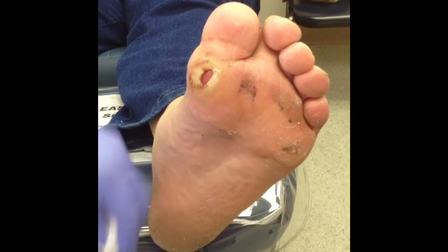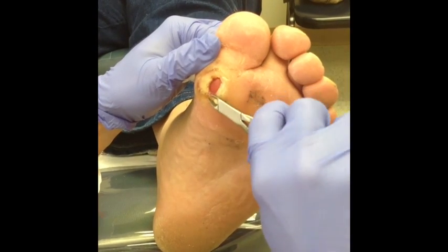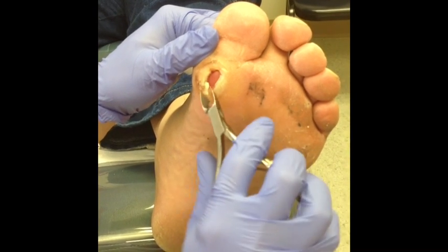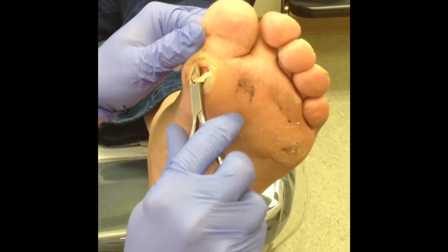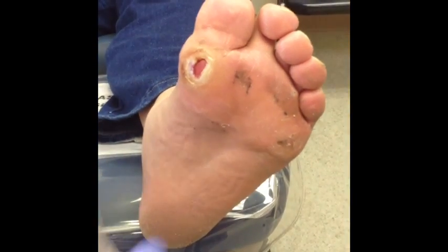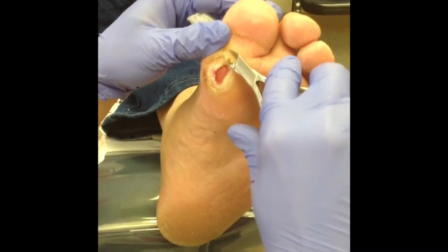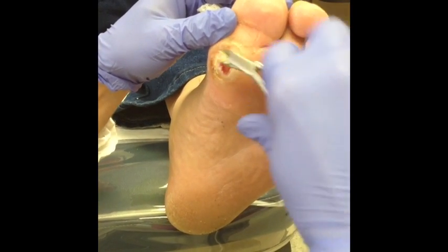Now this doesn't hurt the patient because this patient has neuropathy, but even if they didn't have neuropathy this is just removing callus. It's not actual tissue — as he's groaning up front, it's not hurting, but I guess it is. So sometimes it just hurts a little bit, but for the most part it doesn't hurt that much.